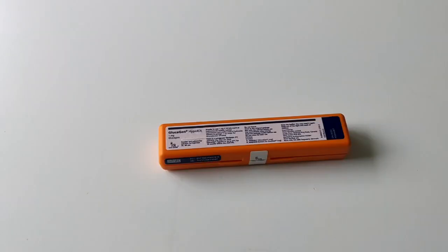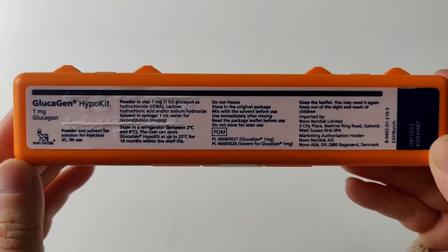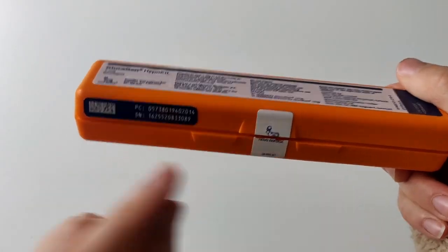Let's go ahead and have a look at this hypokit. For most of this video I will be filming up close to the hypokit. This is how the hypokit looks — it's an orange box and it's made by Novo Nordisk.